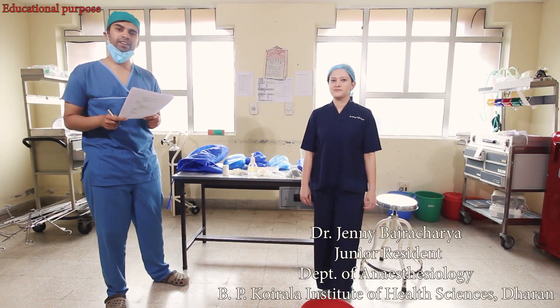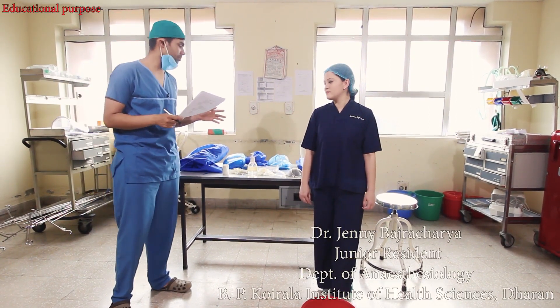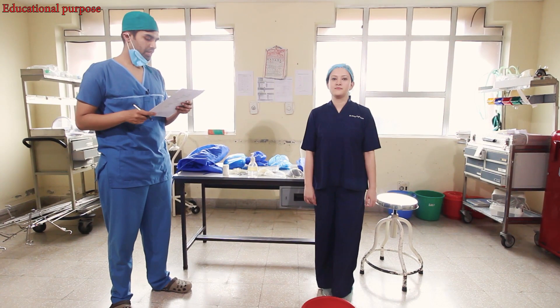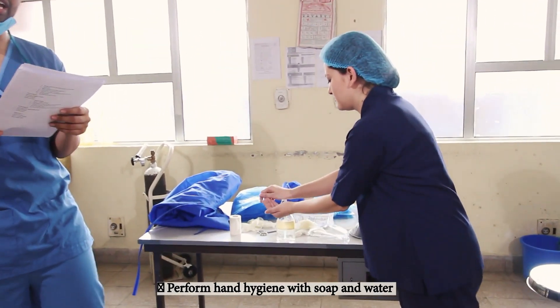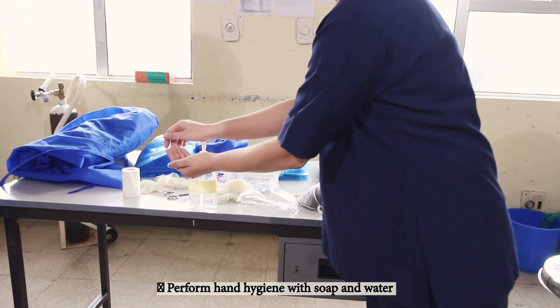Now we have entered the donning area. We shall perform the steps of donning this PPE. First of all, we will perform hand hygiene and cover any cuts or abrasions with waterproof dressing.